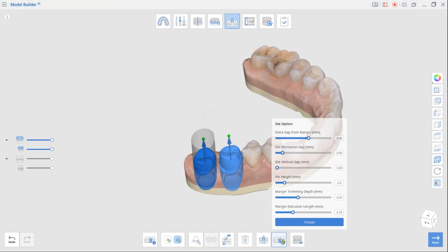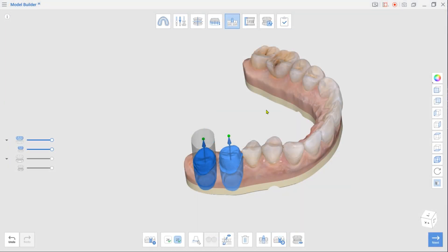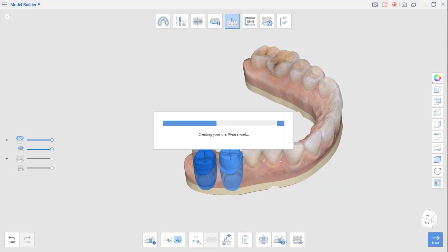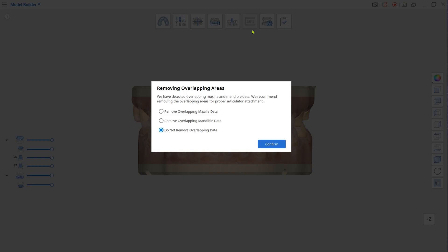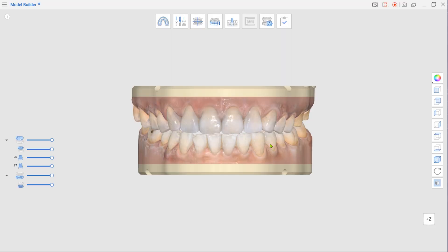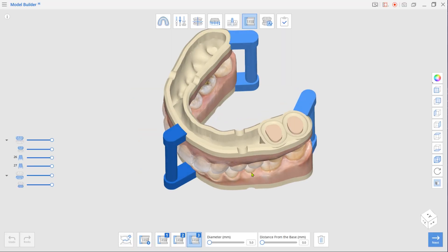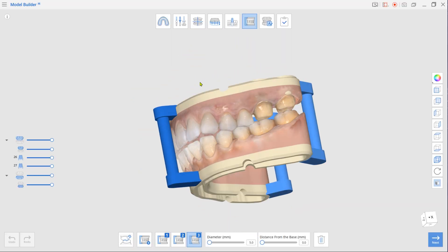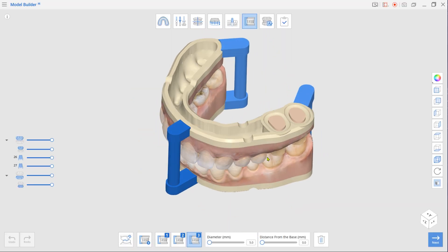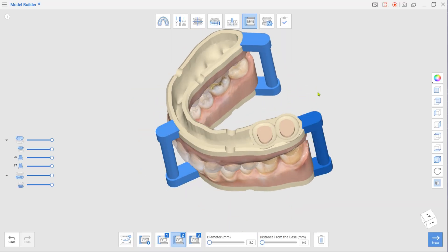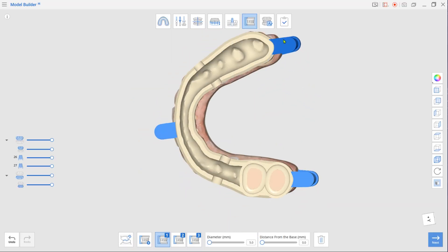Next step is Articulator mode. The program will automatically attach three articulators. Use the Diameter slider to change the thickness and adjust their placement by dragging them.